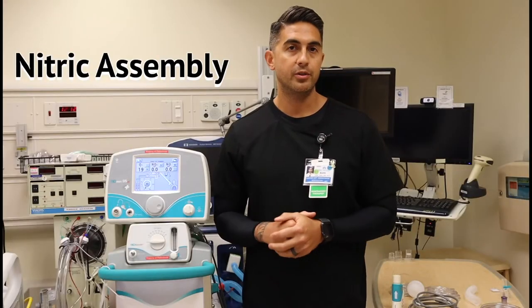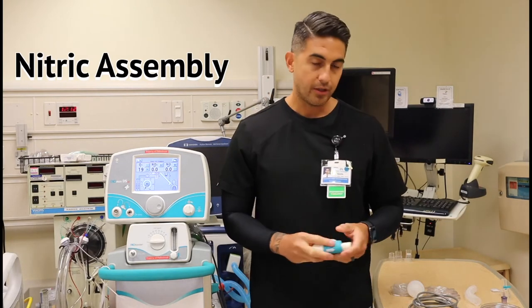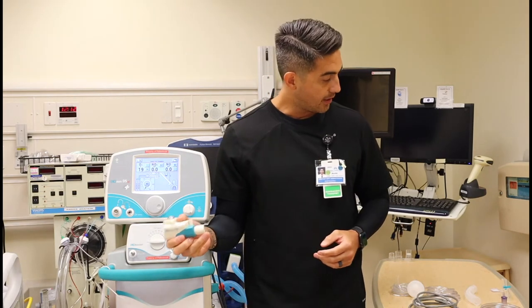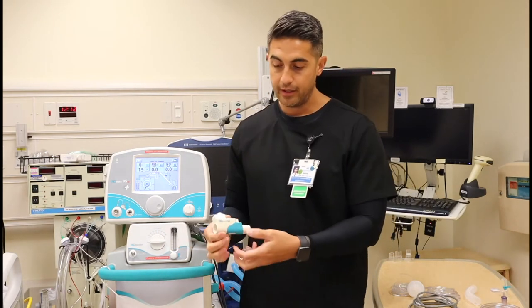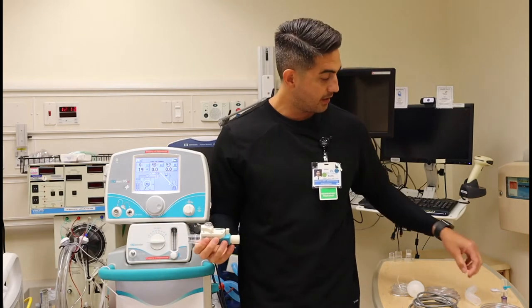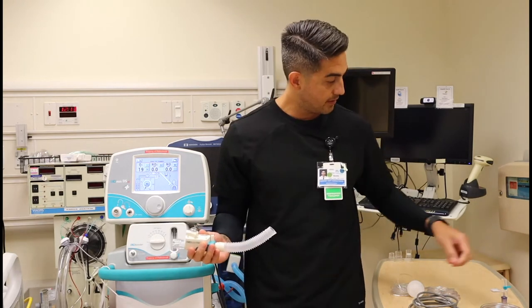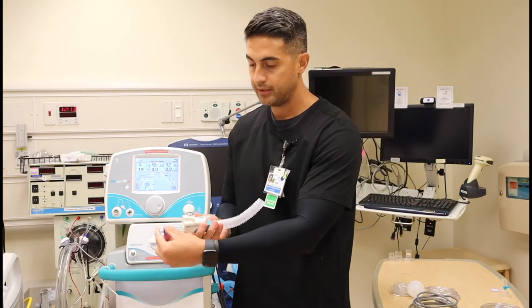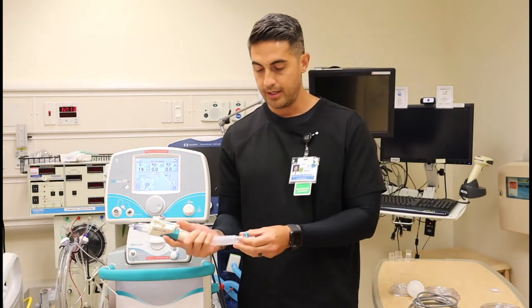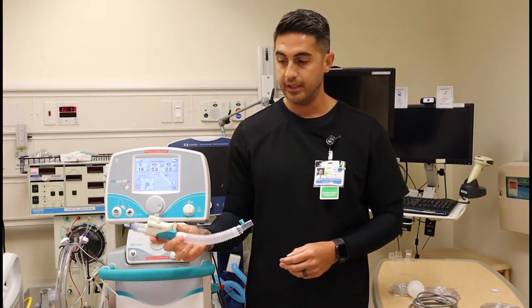Now let's take all the components we just reviewed and put together our pre-use circuit. Start by grabbing the injector module first. Take your 22mm adapter, place that on one side. Your corrugated tubing, add it to the other side. Place your O2 adapter and your sample line adapter. Now our injector module is assembled.